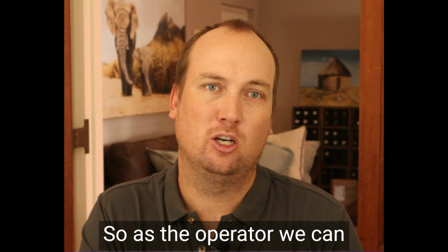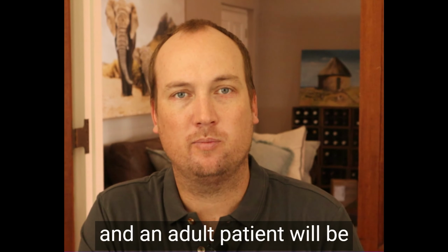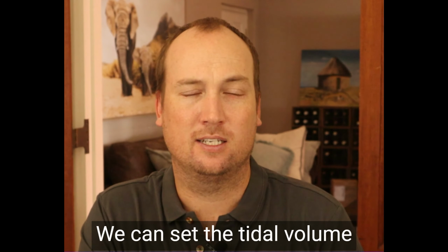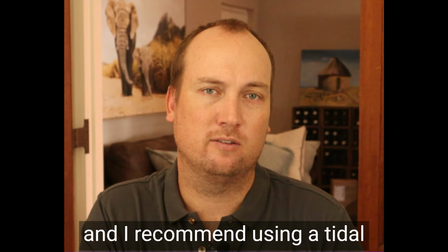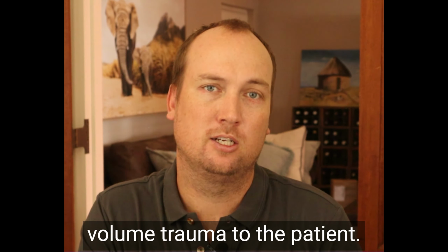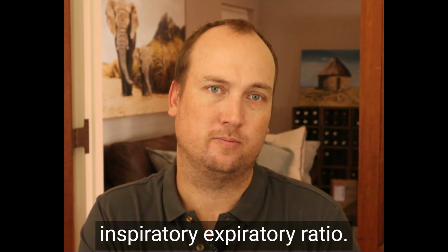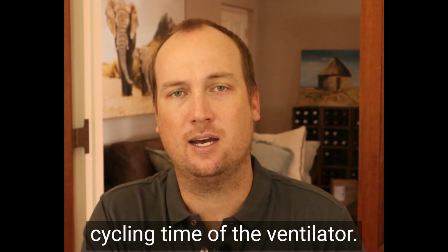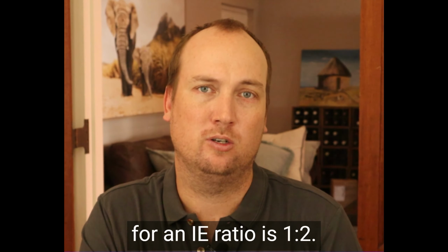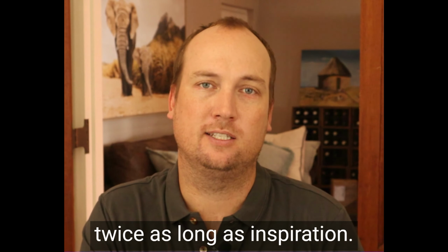So as the operator, we can adjust the respiratory rate. A normal respiratory rate in an adult patient will be somewhere between 12 to 16 breaths per minute. We can set the tidal volume, and I recommend using a tidal volume of 6 mL per kilogram to avoid volume trauma to the patient. And we can set the inspiratory-expiratory ratio. This is how we set the cycling time of the ventilator. So the normal setting for an IE ratio is 1 to 2. That means that expiration is twice as long as inspiration.